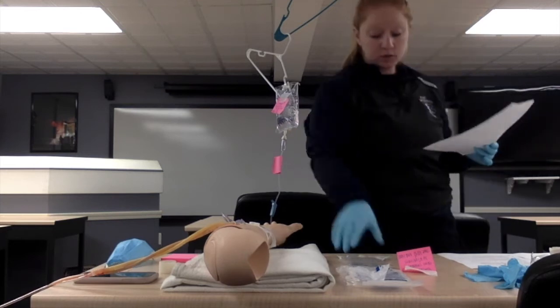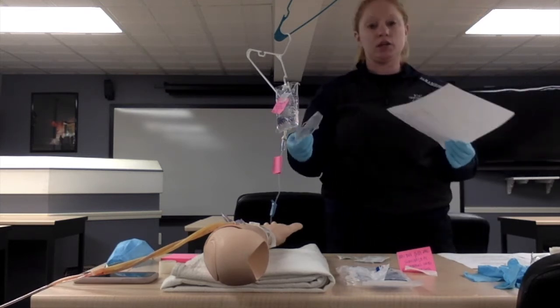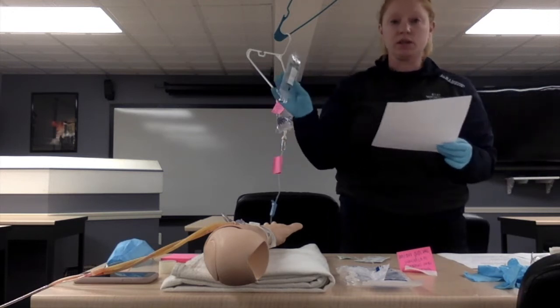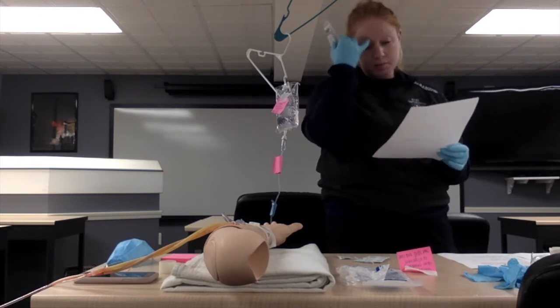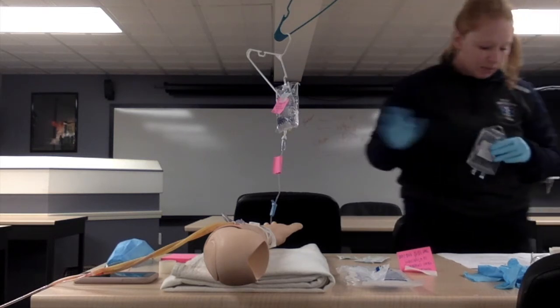So now we have the right patient. We're going to make sure that this is the right medication, the right dose, the right time, the right route, the right documentation, and again, the right patient. So we have 1 gram of Ancef. We're going to check the expiration date, which is 6/22, so we can still use this. We're going to make sure that there's no discoloration, no particulate matter, make sure that it's not opened, anything like that, so we're ready to go. As far as that goes, again, we confirm no allergies.